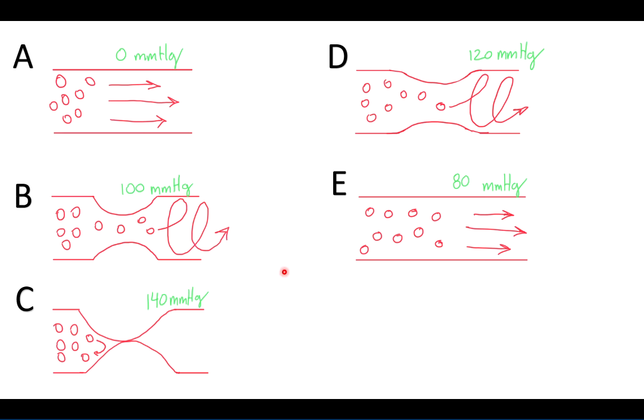We want to continue to inflate the cuff pressure until that sound goes away. So let's say we get to 120 millimeters of mercury and that sound disappears. We want to continue inflating about 20 millimeters of mercury more to ensure we have fully occluded the vessel. So at this point we would stop at 140 millimeters of mercury. Now we're ready to begin the blood pressure test.